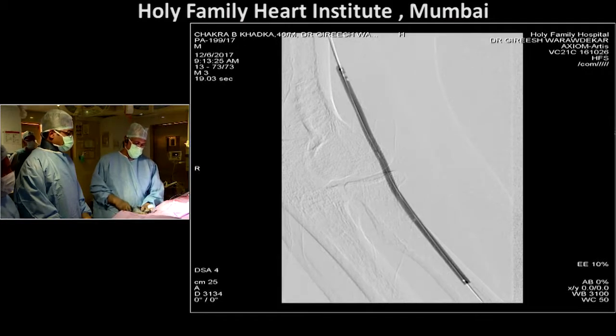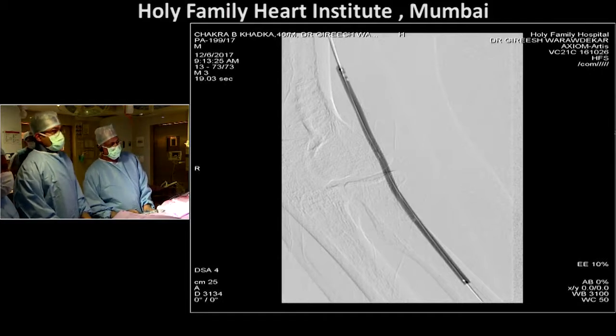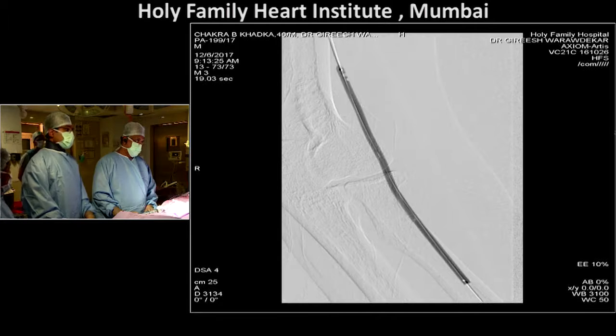And what about the role of thrombolytics here, or any of those drugs? I think at 3 to 4 months, the risk is not justified by the benefit we are going to have. Right. So we have a whole lot of viewpoints here. Maybe aspiration is not a bad idea. And thrombolytic is obviously not much help, because this is more chronic now and it will not lyse. Normally on the arterial side, I've seen success within 24 to 48 hours of acute closure. If you do thrombolytic, it probably works.